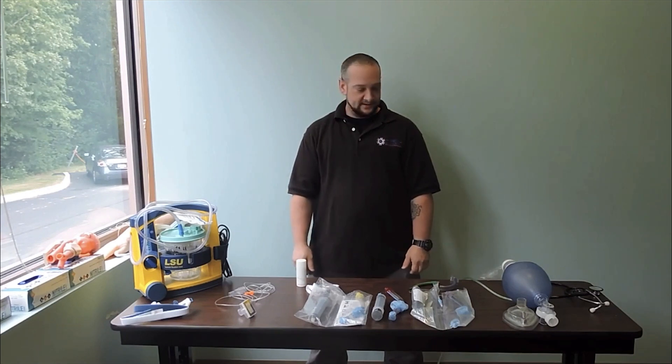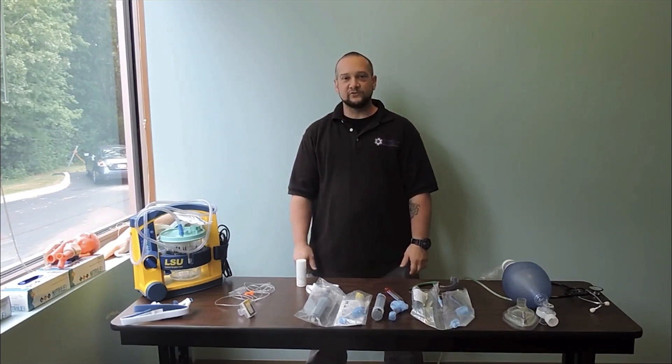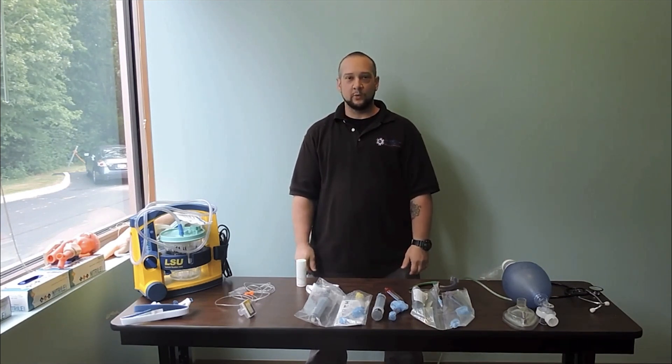Today we're going to go over the indications, contraindications, and a demonstration for our King LT blind insertion airway device.